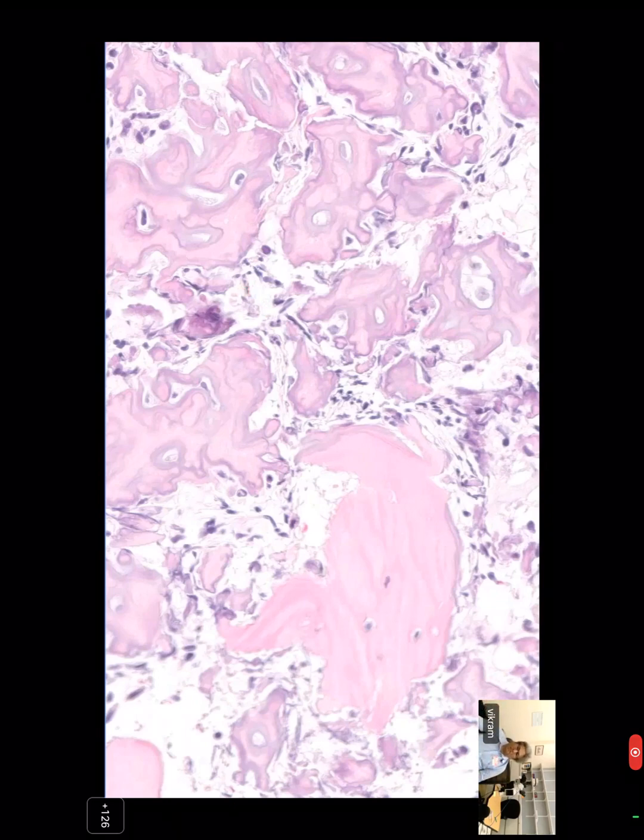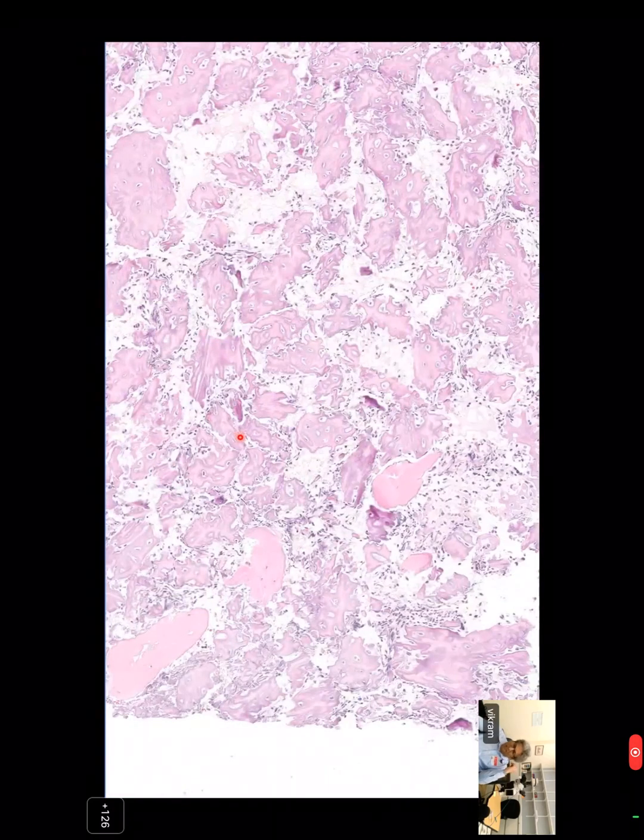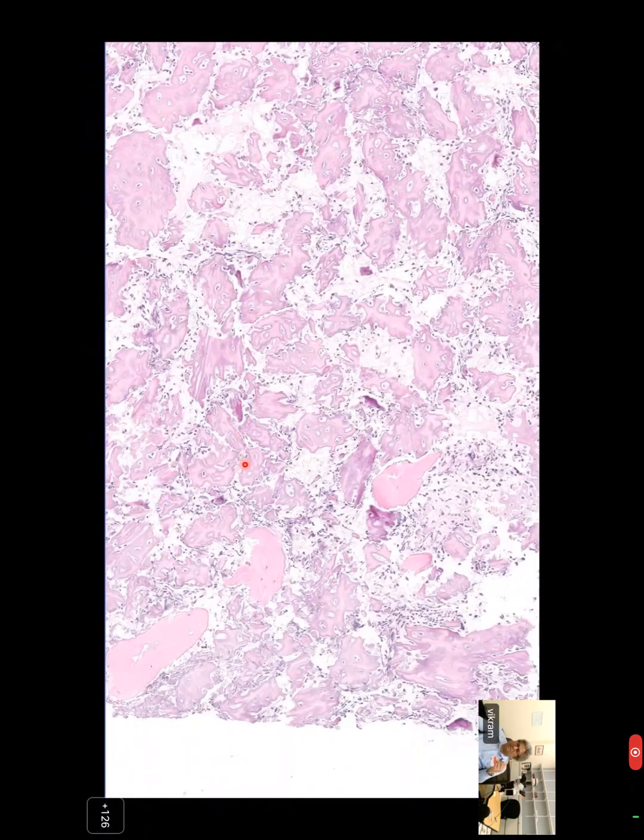And the way you recognize it, and the rule is very simple, a bony neoplasm that infiltrates adjacent host bone is osteosarcoma until proved otherwise, regardless of the degree of atypia. So pay particular importance to the infiltration. It is one of the features that will help you. And for the orthopedic surgeons, when we have trouble, particularly when we are trying to distinguish an osteoblastoma from an osteosarcoma, we'll often ask our orthopedic surgeons to try and scrape out the interface between the bone and the adjacent tumor, and that's where you'll see it.